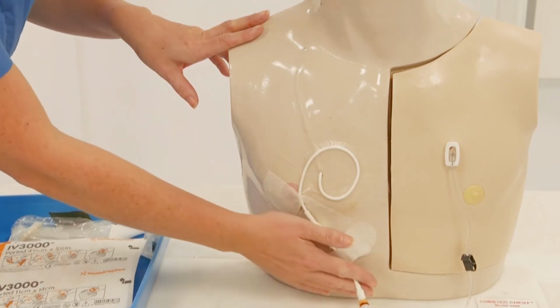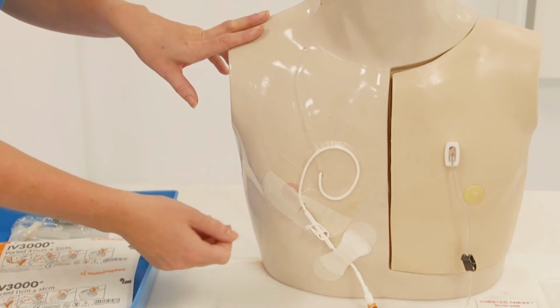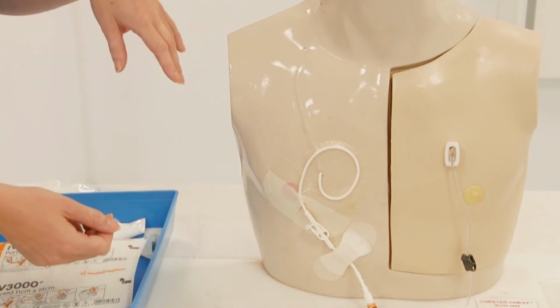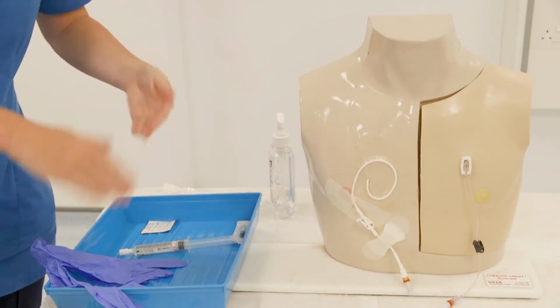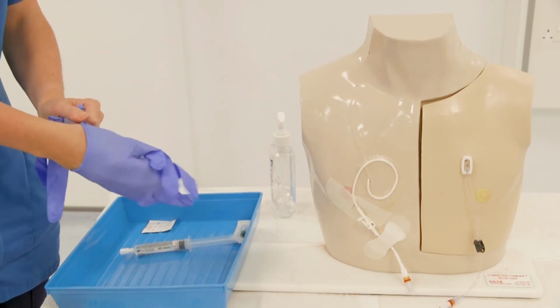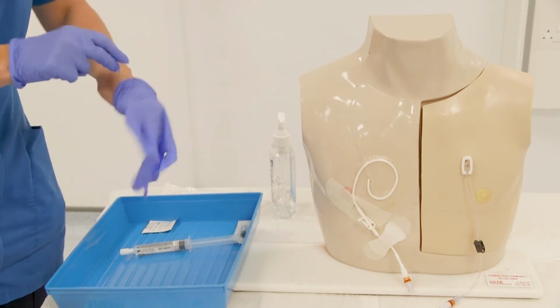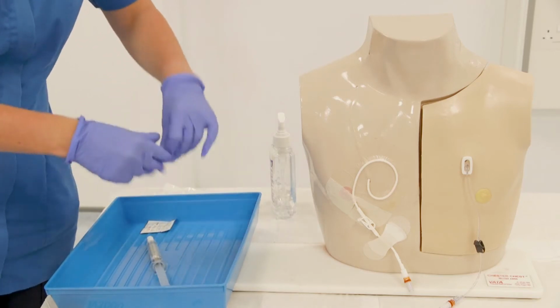When we change bungs, this can again be done with a normal ANTT process. So the next bit we'll do will be just showing you the process of changing that bung. When you are preparing your tray, you can do this as an ANTT process. So make sure your tray is cleaned and that you have the equipment that you need, and just put on a pair of gloves. Because the idea of ANTT is that we aren't going to touch the key parts in this process, we can do this quite straightforwardly.